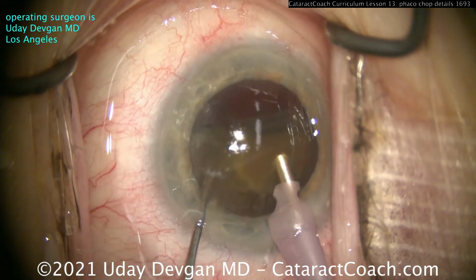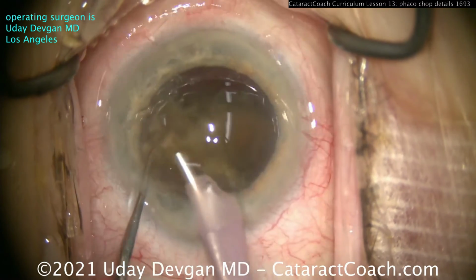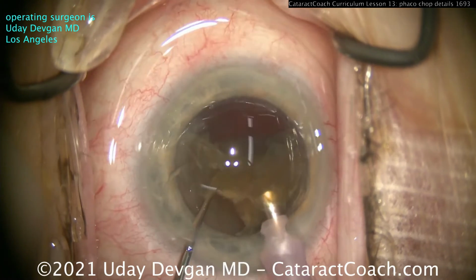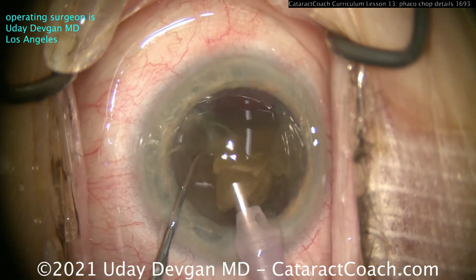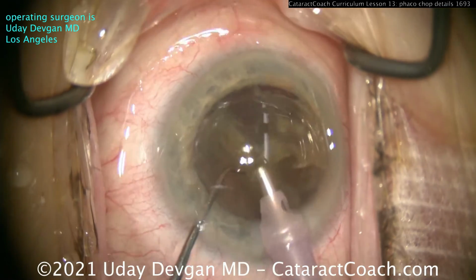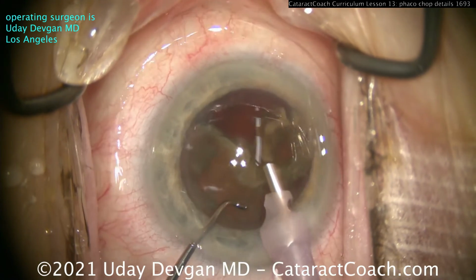Buzz into it again, and let's chop it again. Let's get another chop going. There's another chop. So we keep chopping off little pieces from it. And it's a lot easier and more forgiving to operate this way. Let's do another chop even. So that first half was chopped into 4 small pieces, each about 10 to 15% in size. So total is 50%, and we got about 4 pieces out of that.